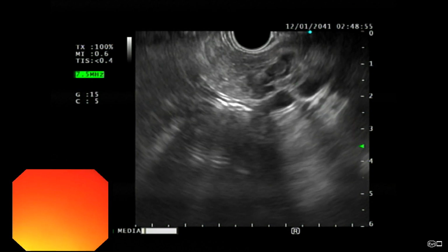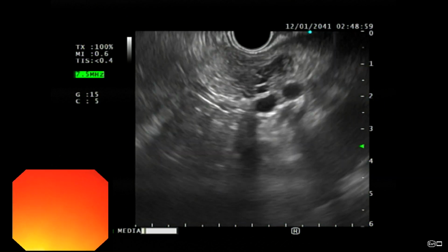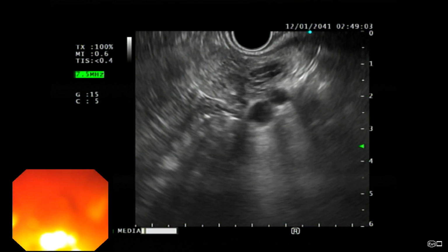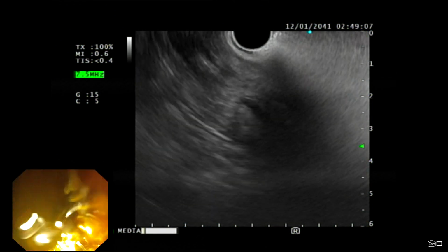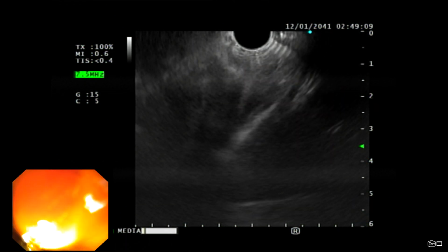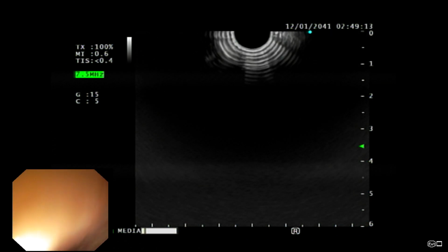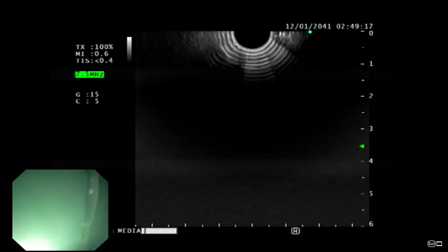I think the question will be if there is relief, if we get across with the wire and put a stent in, and she gets relief, would she benefit from a distal or not? That's been discussed with her over the years. And the patient has been reluctant to undergo surgery. I think, yeah, hopefully the wire can get across and see how she does.